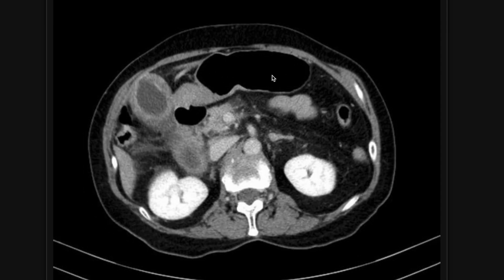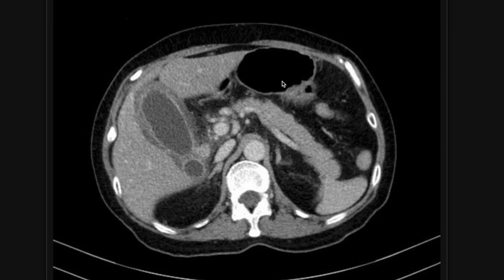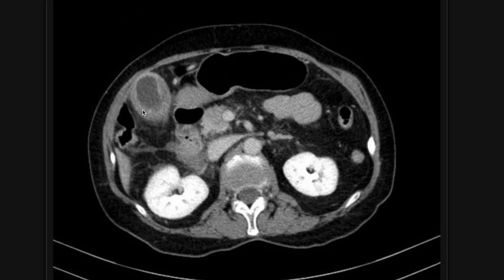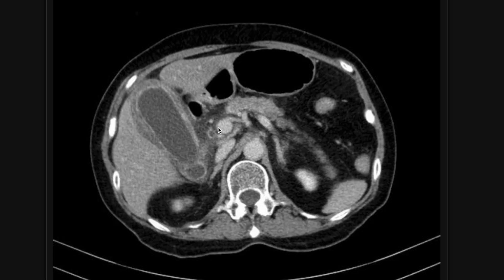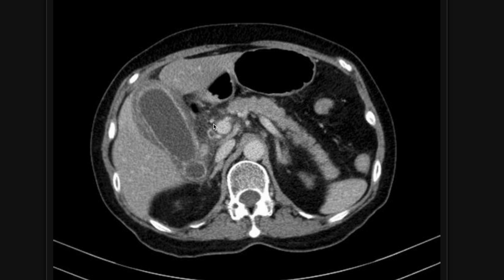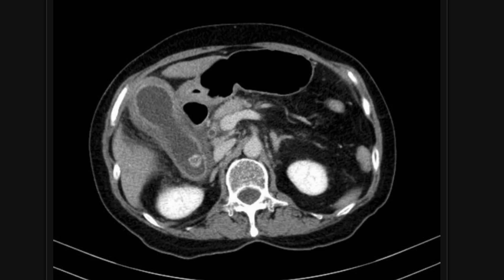I'm going to scroll back through it a little bit to let you get a sense of how this looks. The wall is bright, there's fluid around it, it's dilated — that is too big for a gallbladder. The gallbladder shouldn't be this big in a normal patient. So the gallbladder is dilated, hyper-enhancing, with fluid around it. And look here — this is a gallstone near the gallbladder neck. This could be the culprit that's obstructing the cystic duct and causing acute cholecystitis.